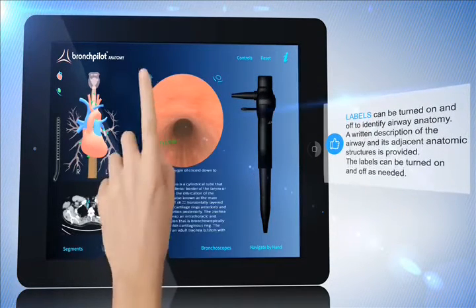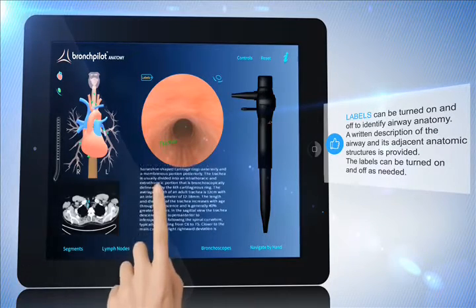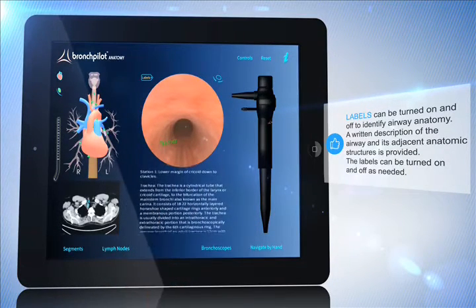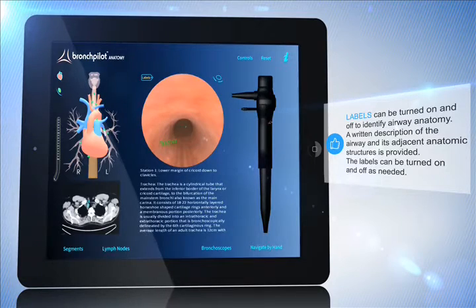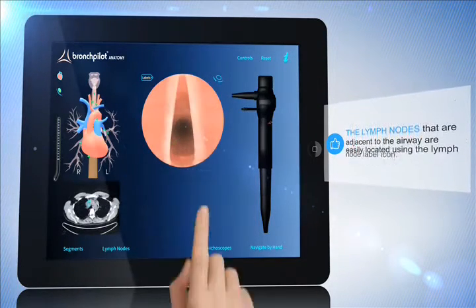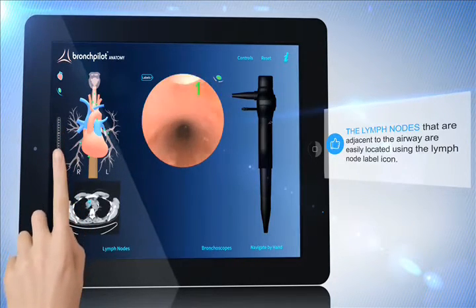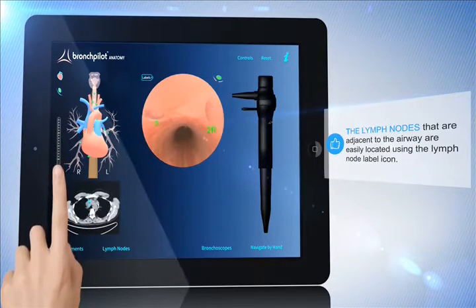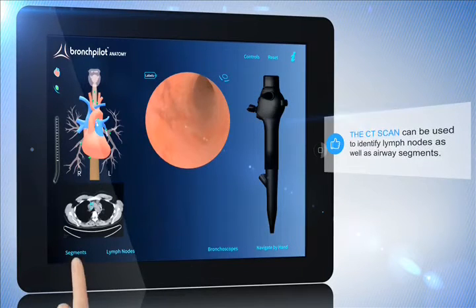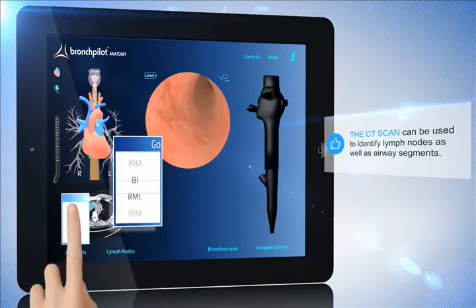Labels can be turned on and off to identify airway anatomy. A written description of the airway and its adjacent anatomic structures is provided. The lymph nodes adjacent to the airway are easily located using the lymph node label icon. The CT scan can also be used to identify lymph nodes as well as airway segments.